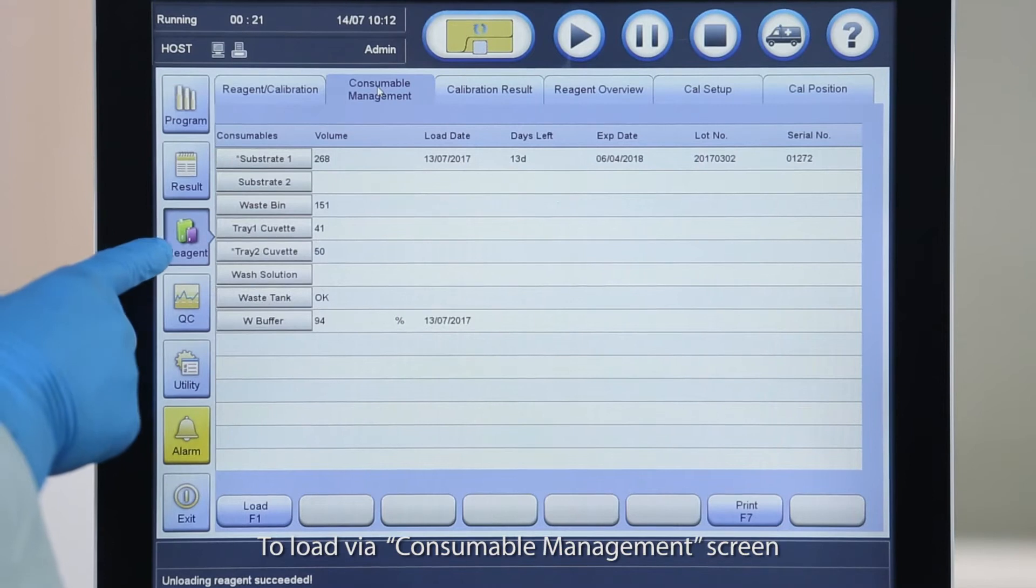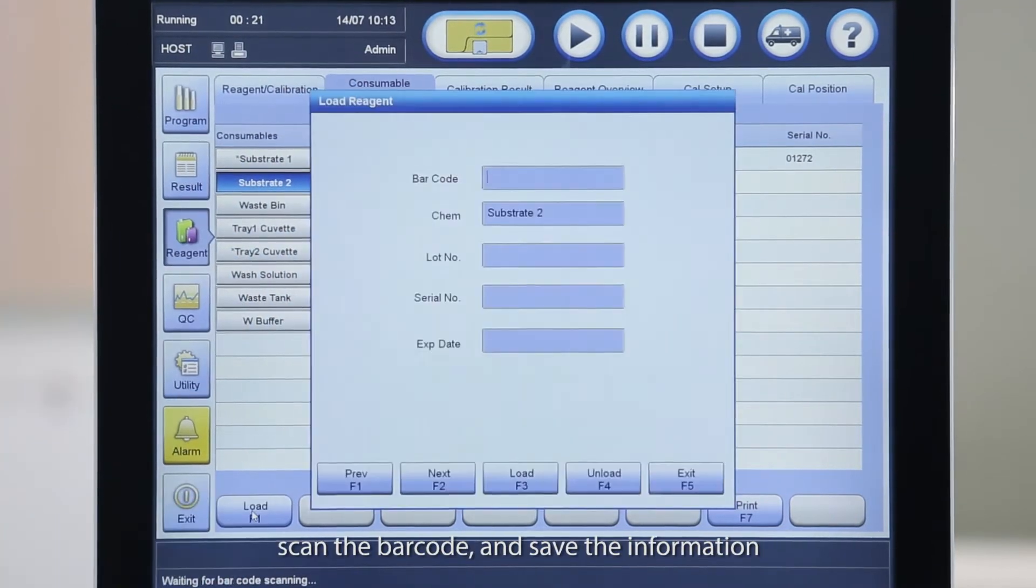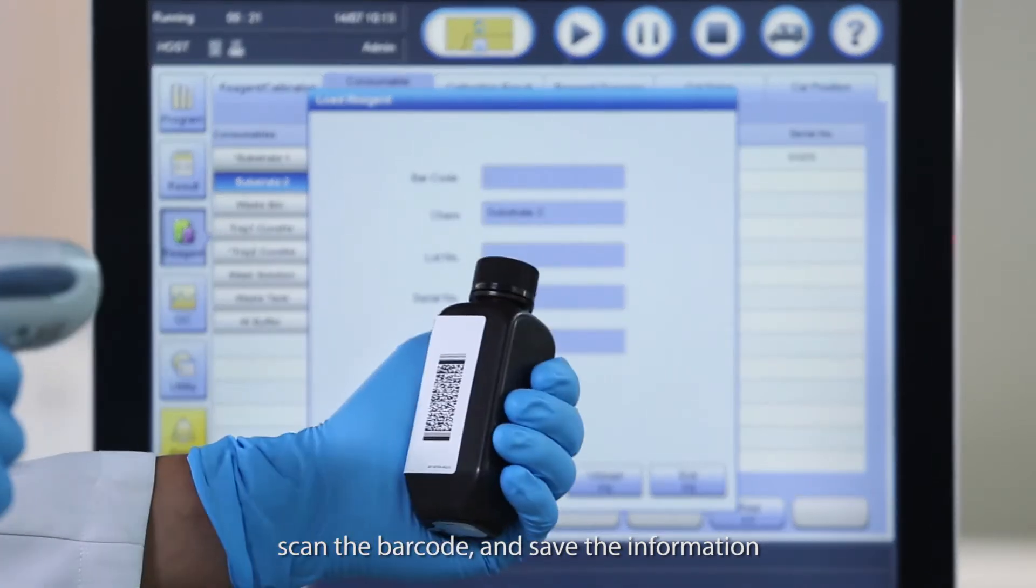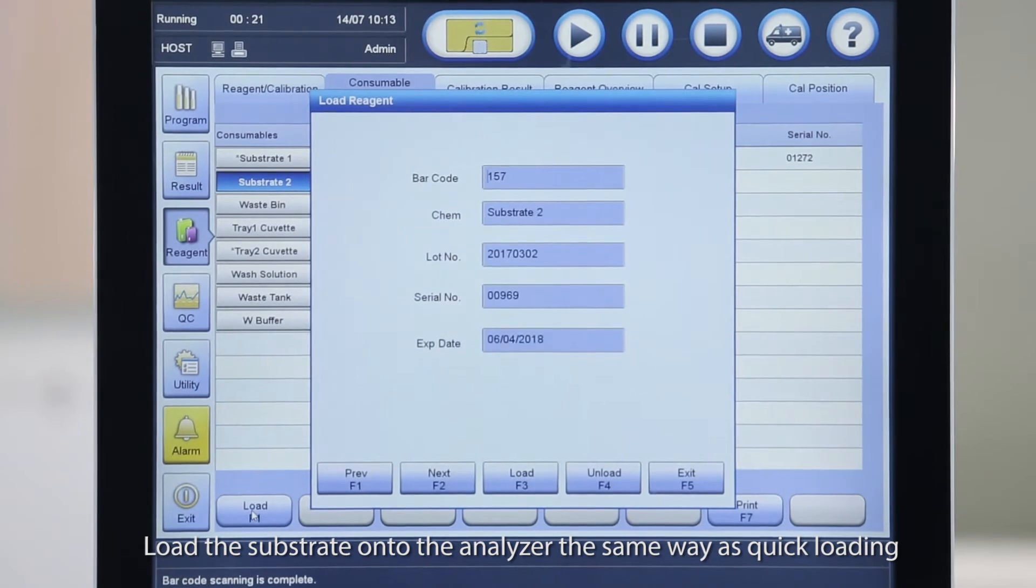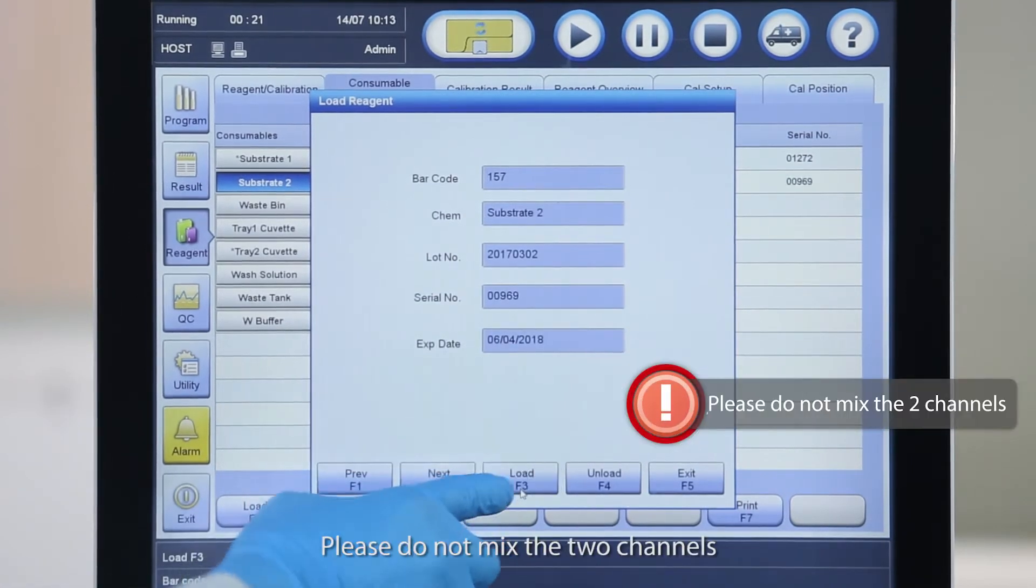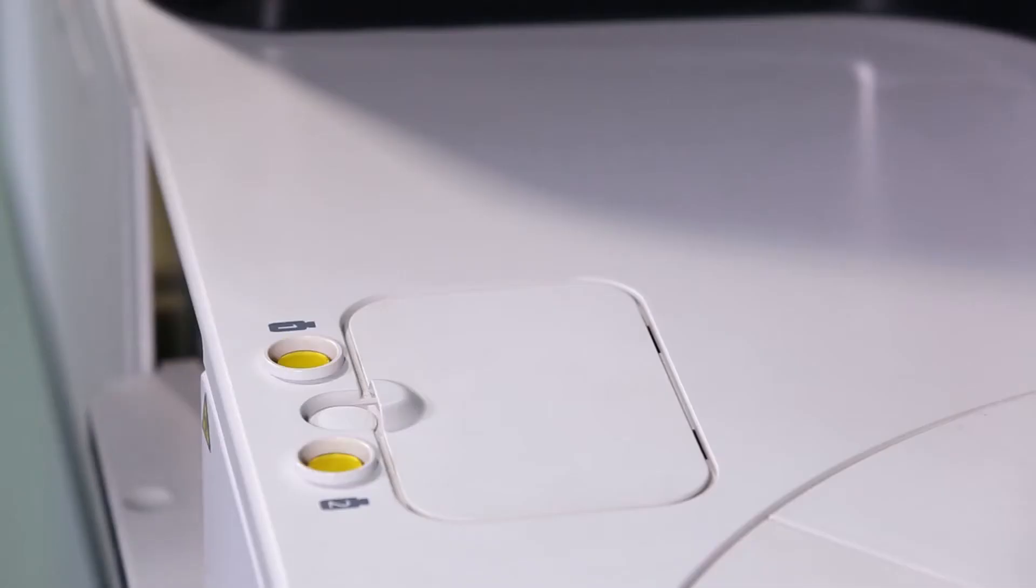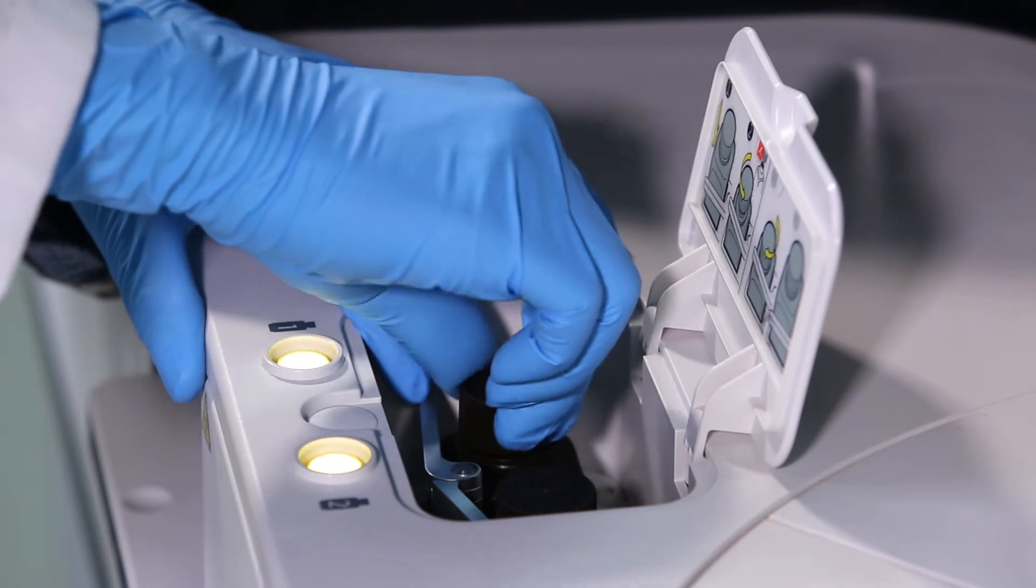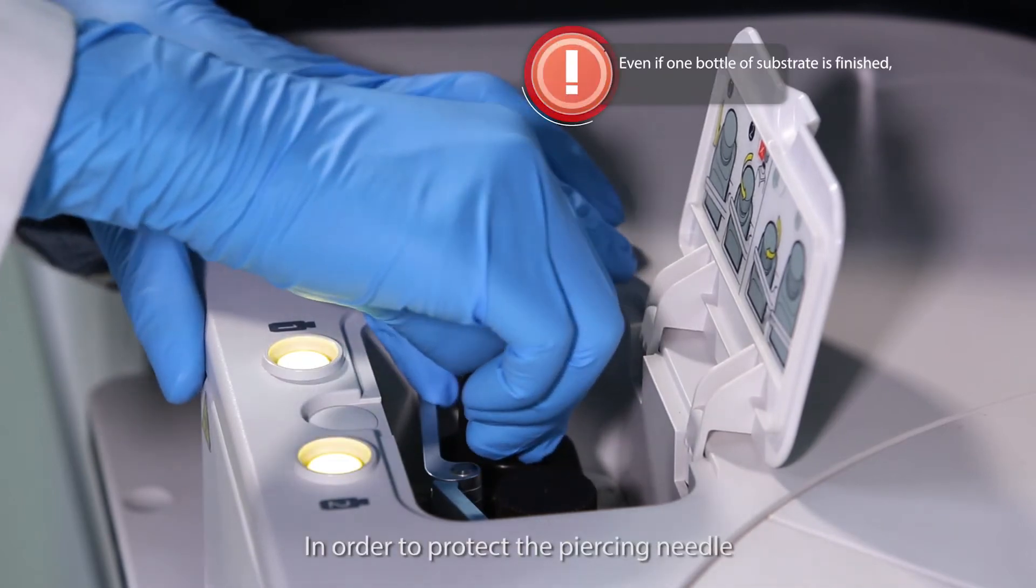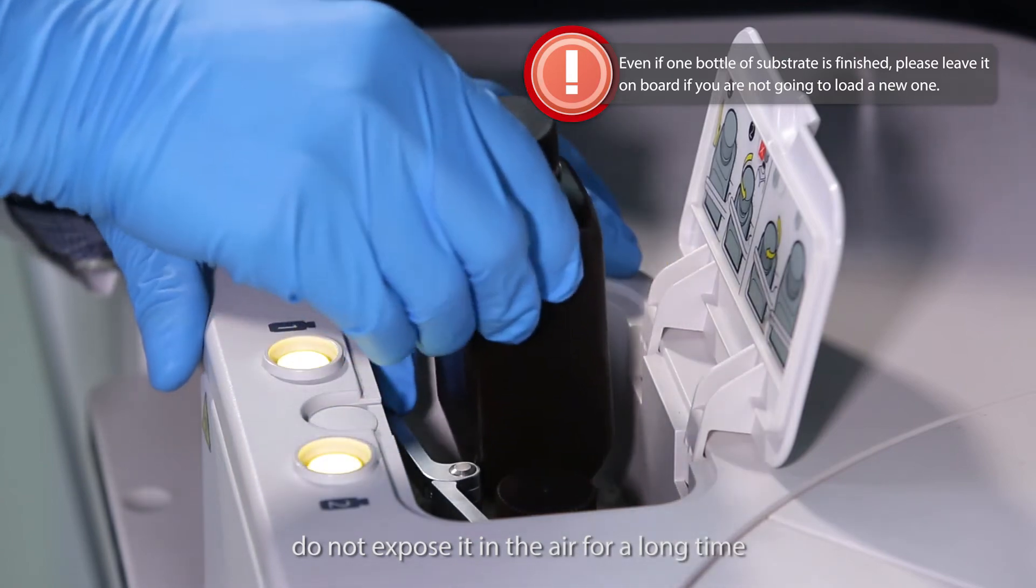To load via consumable management screen, click the available substrate channel. Scan the barcode and save the information. Load the substrate onto the analyzer the same way as quick loading. Please do not mix the two channels. To unload, tightly close the cap and take the bottle out. Load the water. In order to protect the piercing needle, do not expose it in the air for a long time.